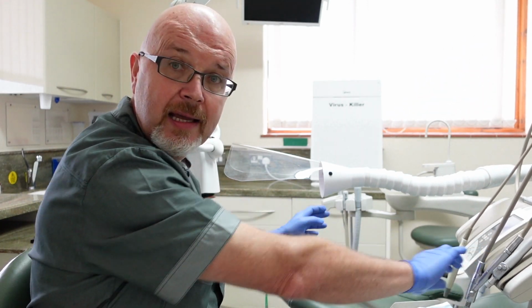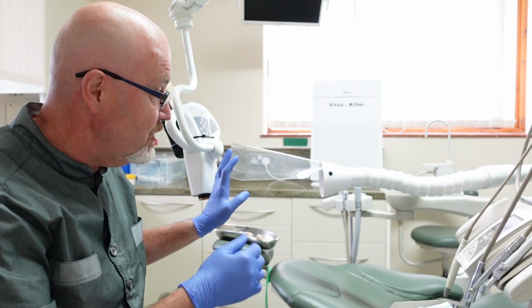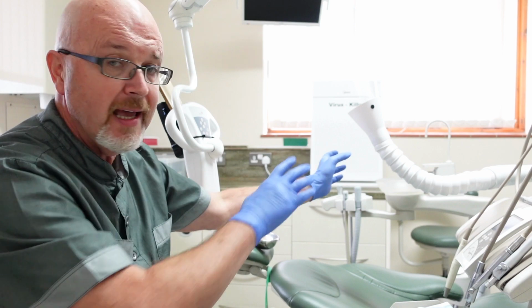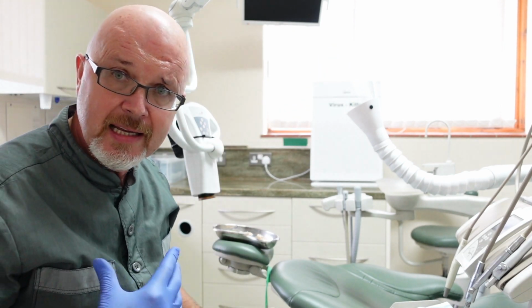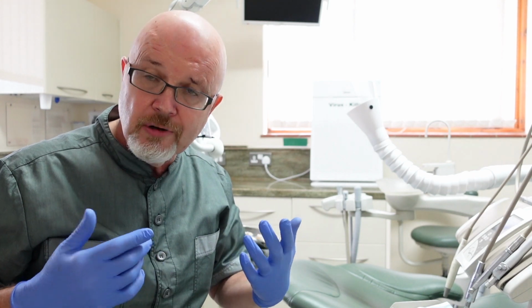Anyway, the purpose of today's video is to use the air turbine using the DentalAIR, which was my winner in relation to practicality of use. You can easily move this in and out of the field of work. You can curl this up, so when the patient is sat there, I can say, if you're going to cough or clear your throat, just do that against this shield here. Even during examinations or non-AGPs, you can almost visibly see the patient relax a little bit, because they realise they're being taken care of.